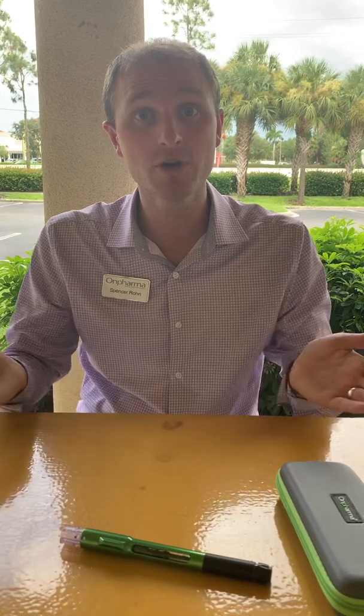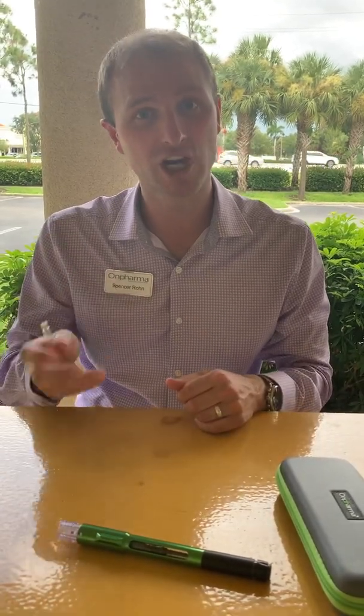If you're not currently buffering your local, what a lot of doctors are doing is they give that injection, leave the room, go do hygiene, and then come back about 10 to 15 minutes later. And you know what? Sometimes you come back and that patient's not numb. So what are you doing? You're giving another injection of local. So that 15 minutes all of a sudden turned into 30 minutes.